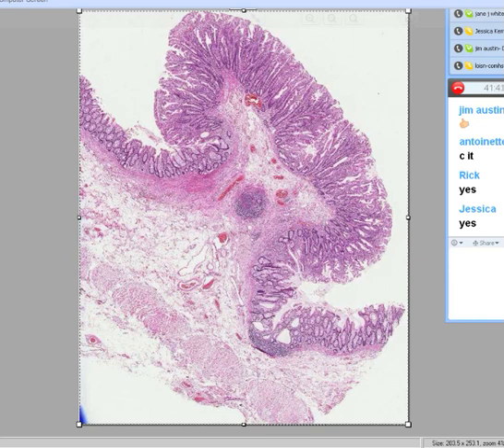Okay, once again, let's go back to our basic algorithms. Before you just get into your little diagnostic mode, you better go back to your airplane and check the basic checklist before you do your fancy flight maneuvers. And your basic checklist is this. If this is a GI organ, then there's the mucosa, there's the submucosa, here's the muscularis, and here's some connective tissue outside the muscularis, which is either adventitia or serosa.